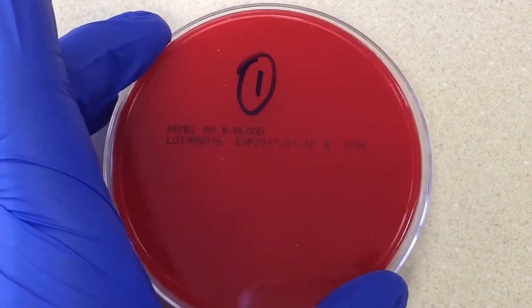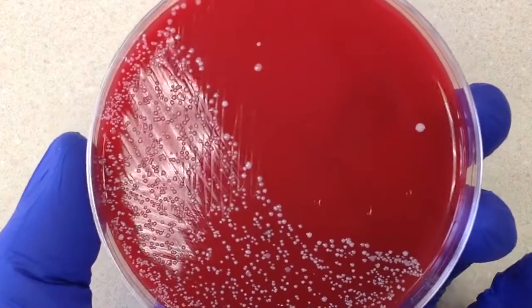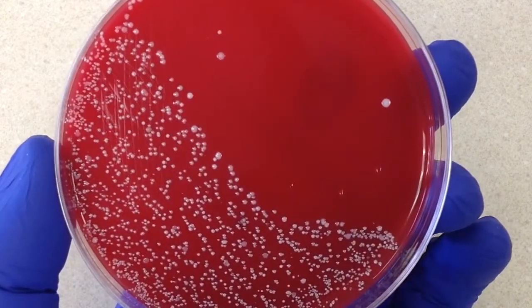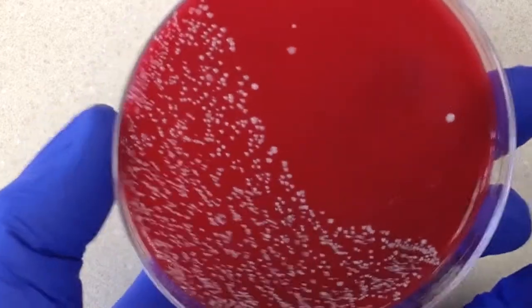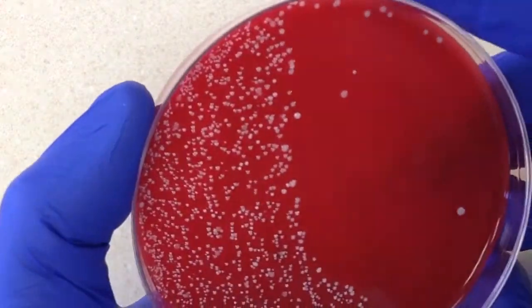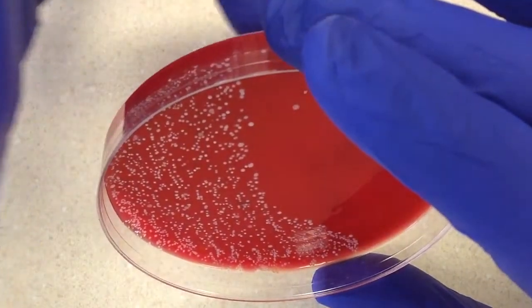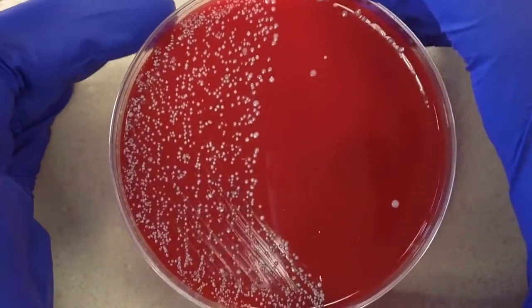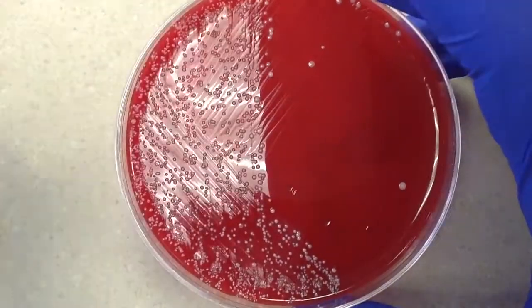So really what we're looking for on this culture is — first of all, it's going to have normal flora, because it's taken by swab from the back of the throat. You're almost always going to find normal flora here. What I would do is tilt the plate with a light source coming from behind, and simply look for beta hemolytic colonies. If I found any beta hemolytic colonies, I would go ahead and work those up.